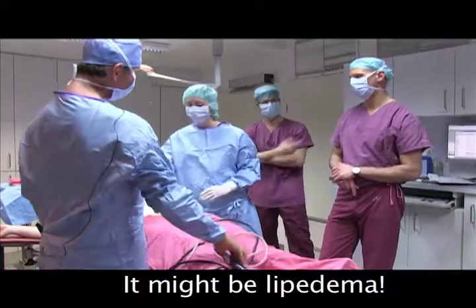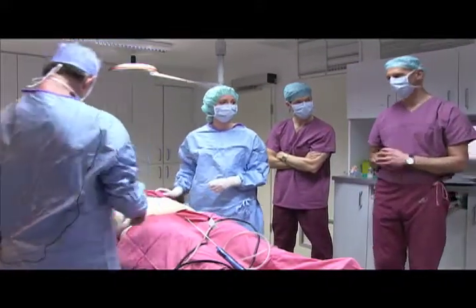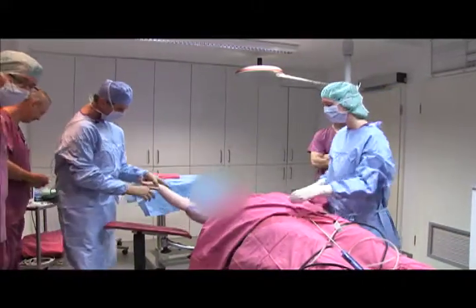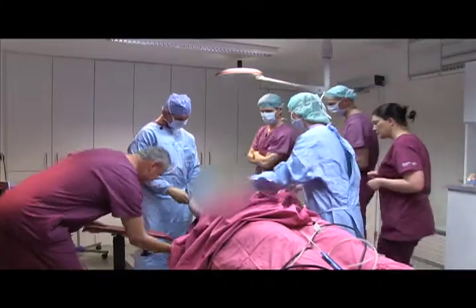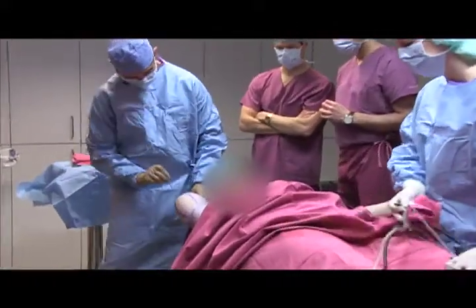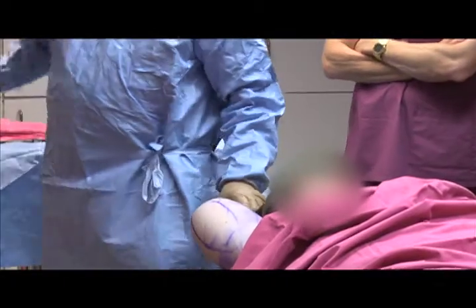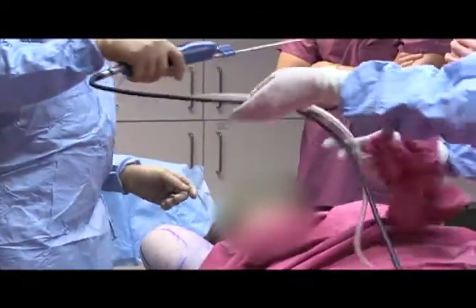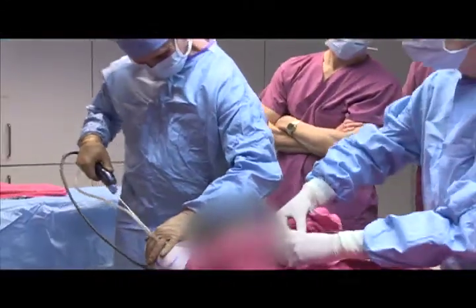We do the arms now. This is where you see that it's important that the patient is awake, because the patient will help. Can you hold the arm? You have a bit of support — it's very hard. I can hold him.